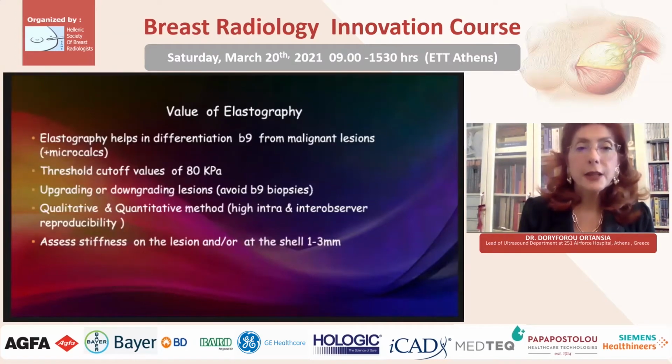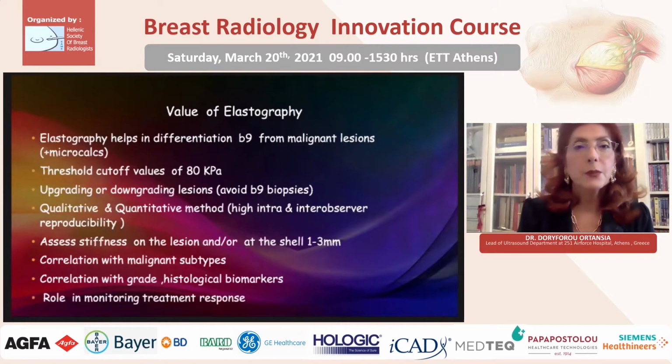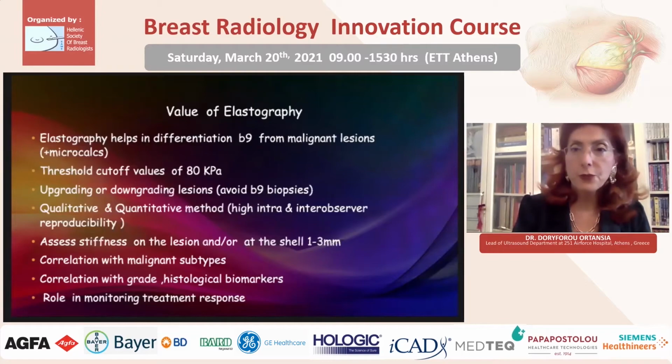It can assess the stiffness of a lesion, inside the lesion or in the periphery, the so-called shell, which measures 1 to 3 millimeters. There is a correlation with malignant subtypes, and there is correlation with grade and histological biomarkers. Of course, there is a role in monitoring treatment response.